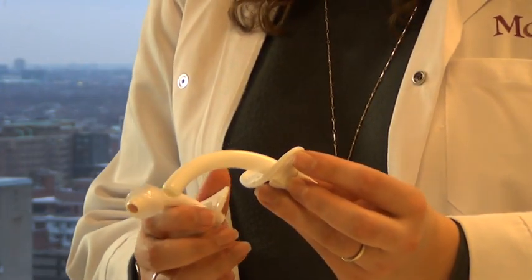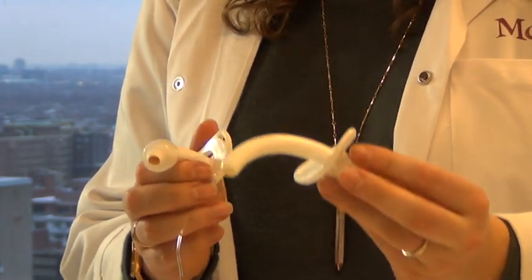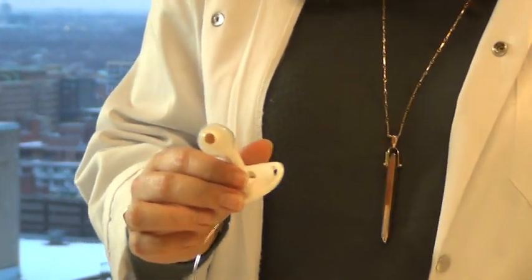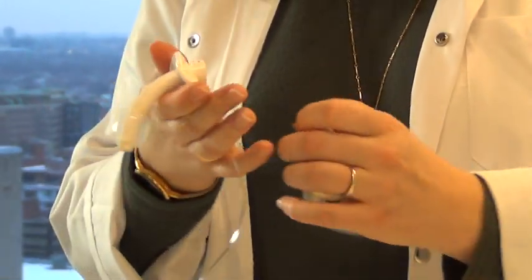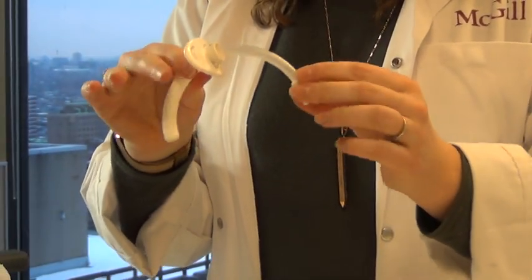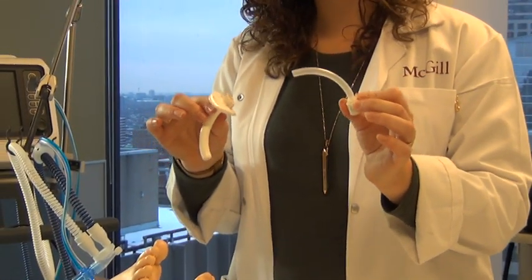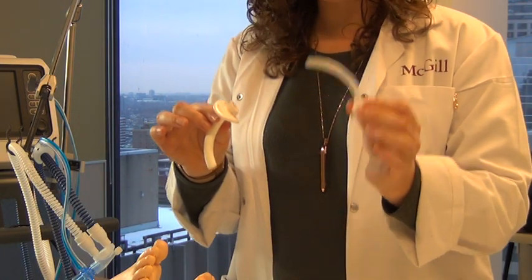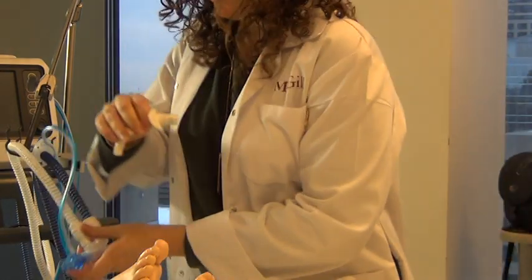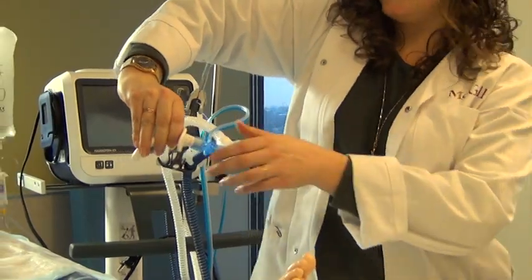In the event that they would require mechanical ventilation in a critical care unit, we would have to switch the tracheostomy, and that would be done by one of the teams of physicians that would change this tube. With the tracheostomy, this one for example, or similarly to this one, you have an inner cannula that you can remove in order to clean. This is an inner cannula that you would keep, so it's not a disposable inner cannula, but these inner cannulas, once they are in, are connected directly to the tubing from the ventilator as such.